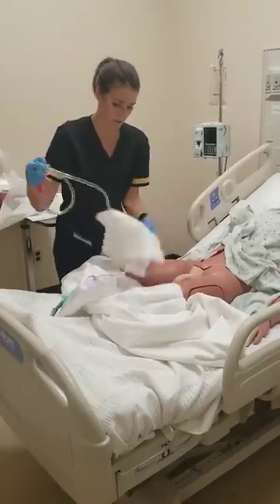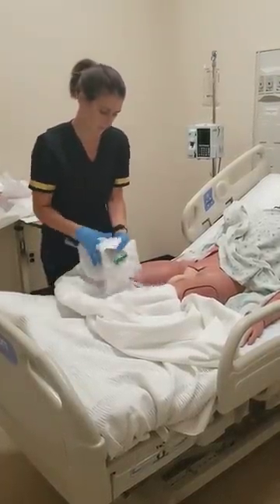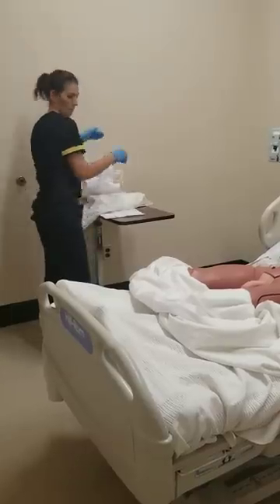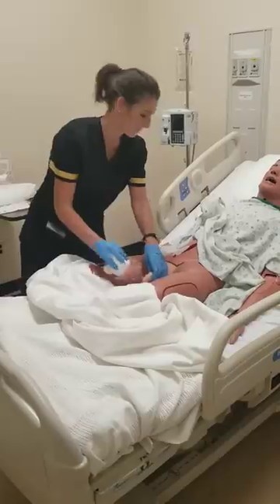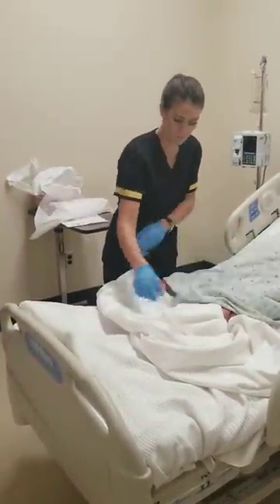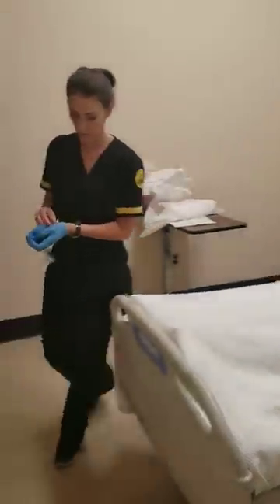And you're all done. Dispose of everything. Make sure that we don't have any more mess. I'm just going to clean you up one more time. Okay? I'm going to remove these gloves.